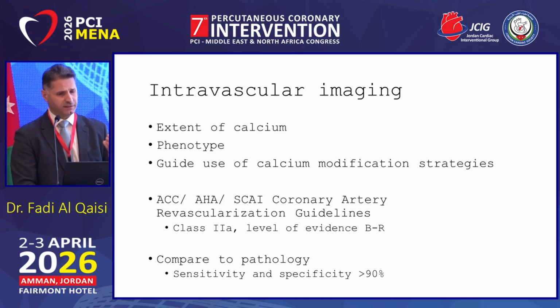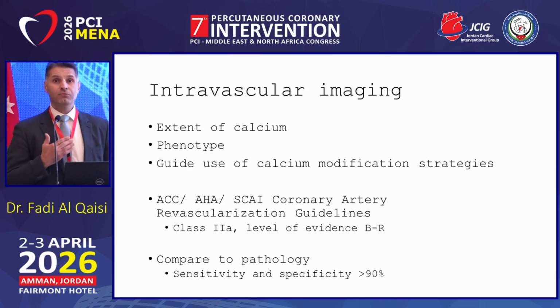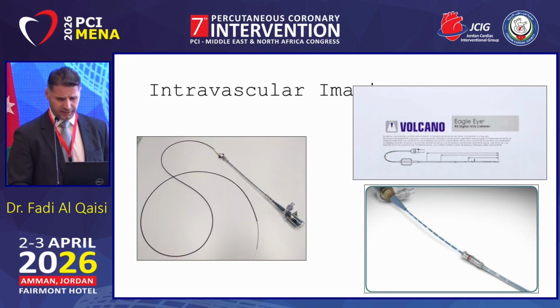فالintravascular imaging الحلو فيه يعطينا extent of the calcium, phenotype, and it guides us to use the modifications. And by guidelines, it's class 2A for plaque evaluation. We have to remember the recent study about the value of the IVUS with the left main. There is a difference between using the IVUS for sizing and optimization of results, which is the traditional use. But more and more recently, we are talking about the IVUS for plaque understanding, plaque characterization, which is totally different usage of the IVUS. طبعا IVUS compared to pathology is very accurate one.